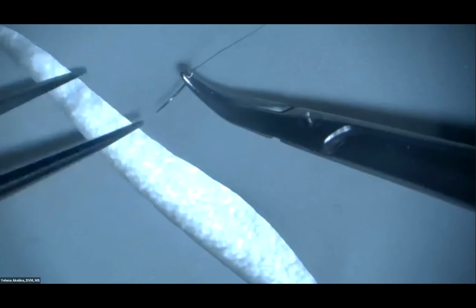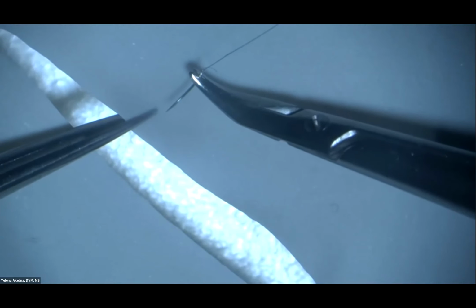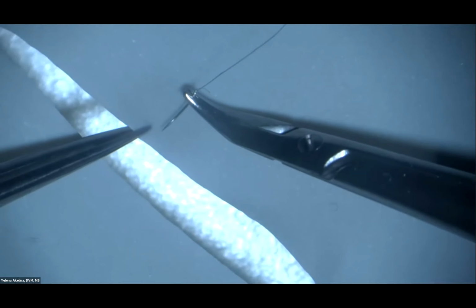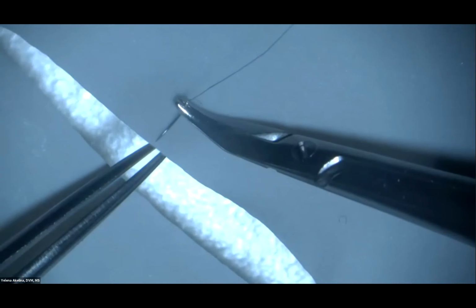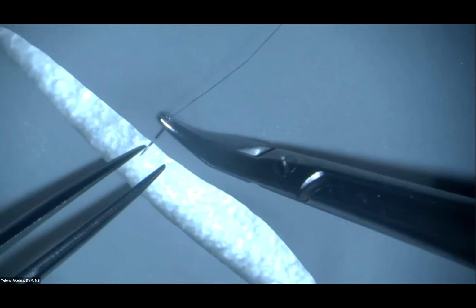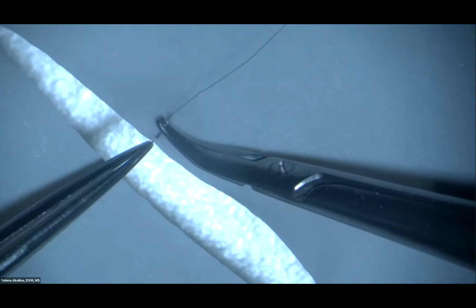In microsurgery, we do not do this, like grabbing the tissue when you're entering for the bite. In microsurgery, we put the forceps underneath and you take a small bite. This is how we start practicing. A small bite is one or two diameters of the needle from the edge. And you do the same thing on the other side.